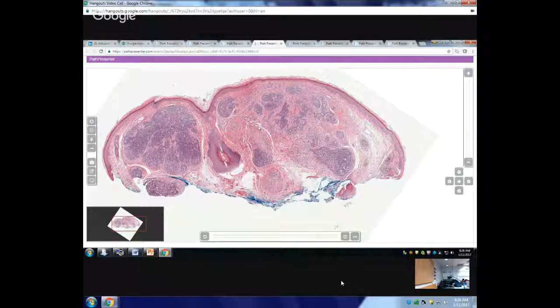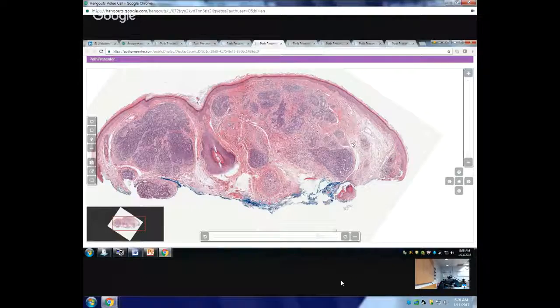The important thing is how do I first rule out a basal cell carcinoma. Then, till your boards, you have to remember the name trichoepithelioma, because on the board you cannot call this a benign basaloid neoplasm. You have to give it a name. So if you are going to call it trichoepithelioma, what are the features that you want to look for? One is the fibrotic stroma, second is the keratocyst, and third is this papillary mesenchymal body.